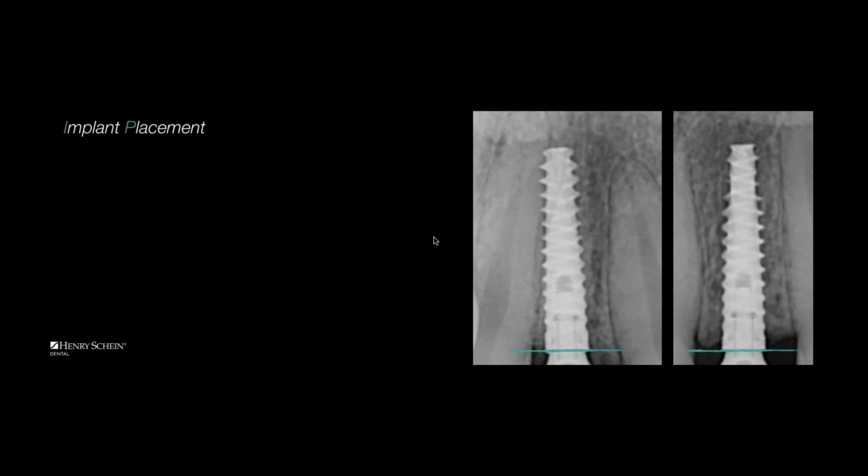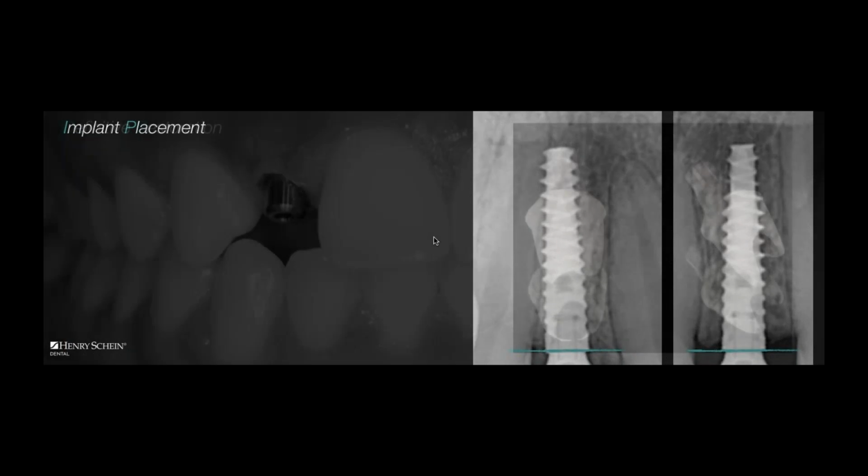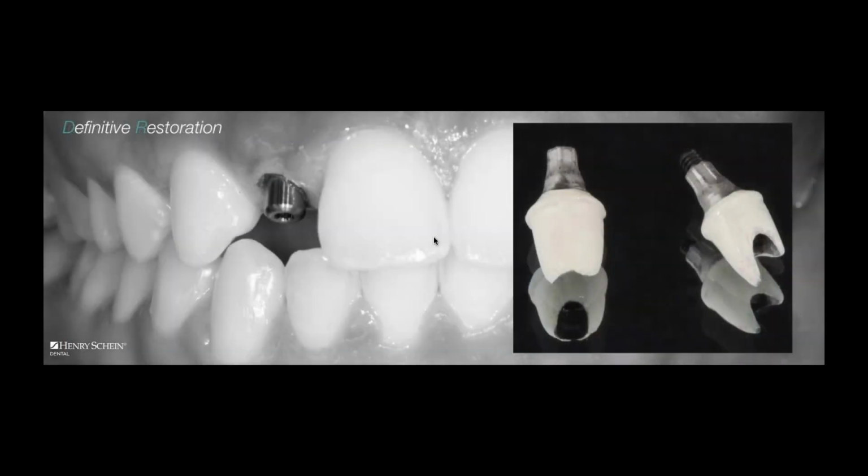And in this wonderful world of CAD/CAM that I've been living in, the only thing my dental technician and I could come up with was to wax and cast 2 UCLA style abutments with a high noble alloy, stacked porcelain to create a custom porcelain emergence, a custom porcelain margin, and opaque the whole thing with porcelain. Let me say that in English. The price of 2 CAD/CAM abutments is X. The cost of the 2 UCLA style abutments is the same price.